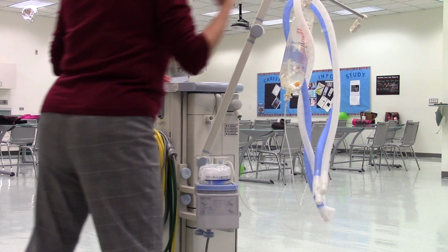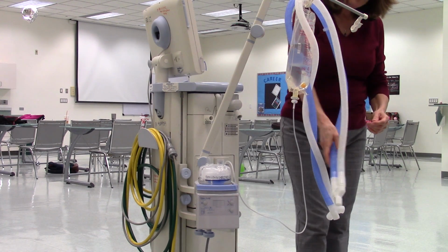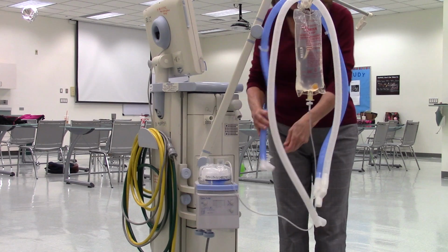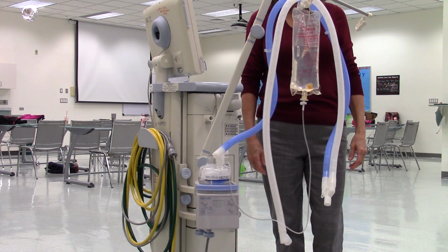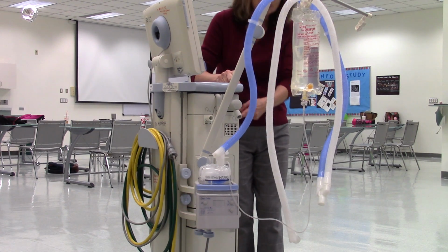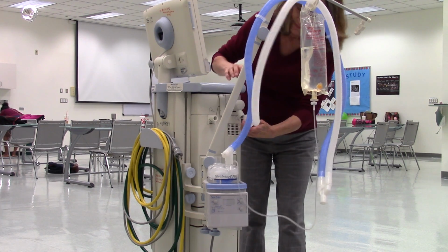So I've got the circuit on the arm. It says, connect the inspiratory limb of the heated wire circuit to the humidifier. All right, so the inspiratory limb we've already identified because we know where the temperature sensor is. And it wants me to put it on the humidifier. Correct. Then it says, connect the expiratory limb of the circuit to the exhalation port on the ventilator. All right, for this ventilator, it's labeled EXP for exhalation port and INSP for inspiratory port. So I'll connect to the expiratory port.